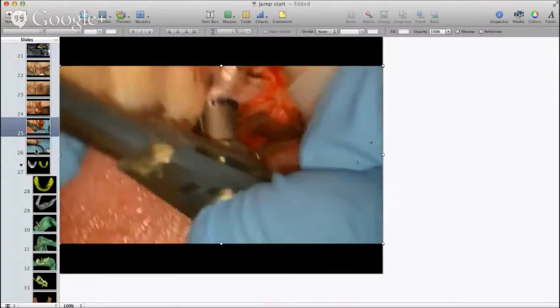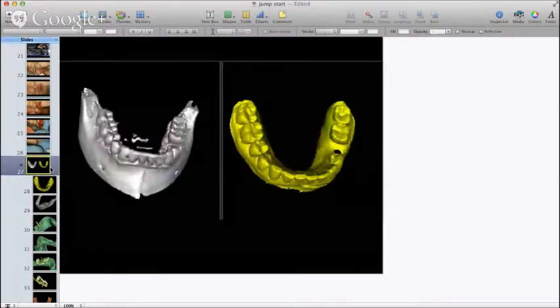We have a surgical stent in place. You follow the drill protocols — every implant company now virtually has a fully guided system, which is a separate system from the traditional one you may have in inventory. Once your surgical drills hit the sleeve, you have gone to depth. I no longer stop to take x-rays with guide pins to see if I'm on the right track. This is the easiest procedure I do in my office — I sweat over class 2 composites way more than I do over guided surgery. On average, these single units take me no more than 5 or 10 minutes, and most of that time is because I'm recording the procedure.